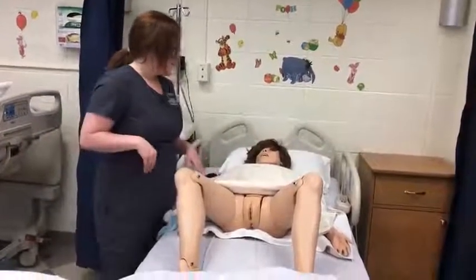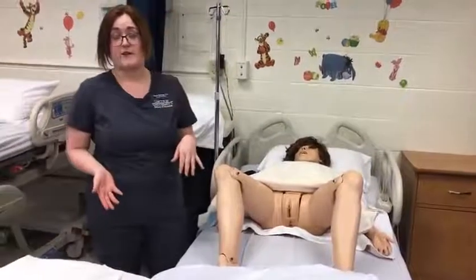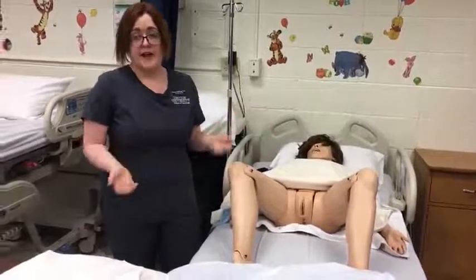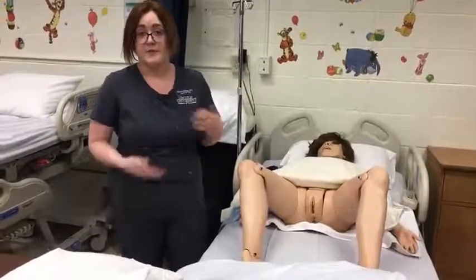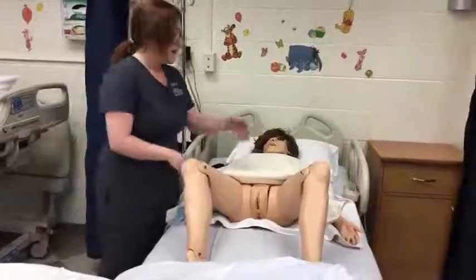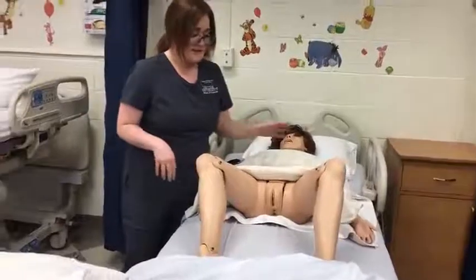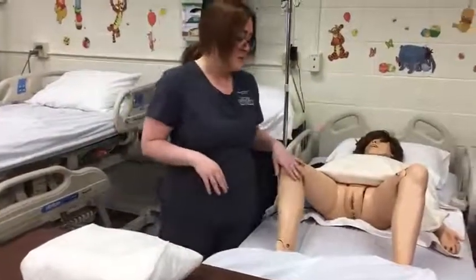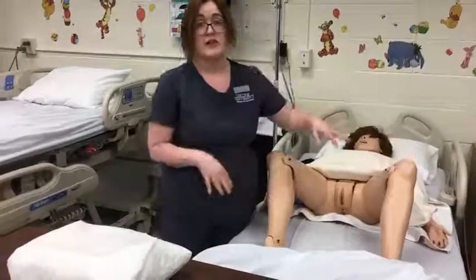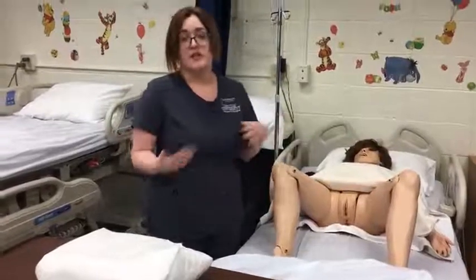Before beginning the procedure and getting her into this position, I also discussed the reasons why she is getting a Foley catheter, which in this case is to drain urine from her bladder so that she doesn't have to go to the bathroom herself. I have helped her into a comfortable position, provided patient privacy, and helped her into a frog leg position. I've also informed her that she needs to stay in this position because once I start opening up the sterile field, it's important that she doesn't cross that, otherwise we will have to start over again.